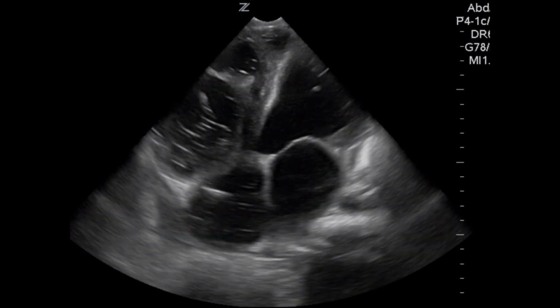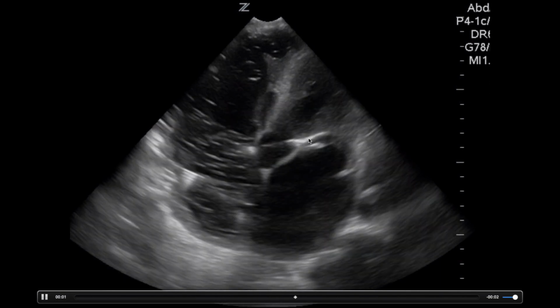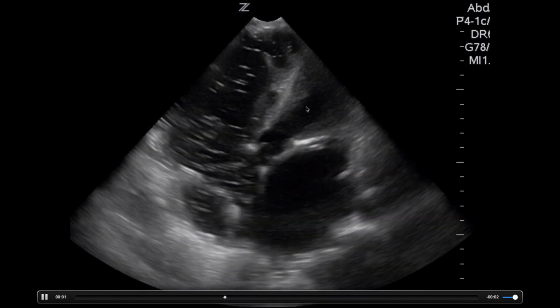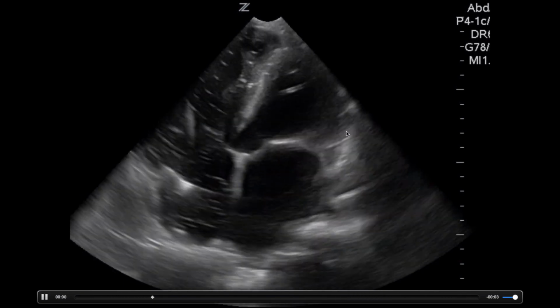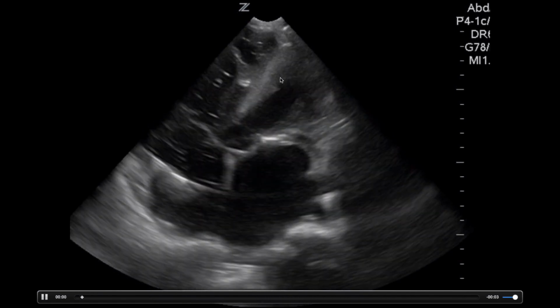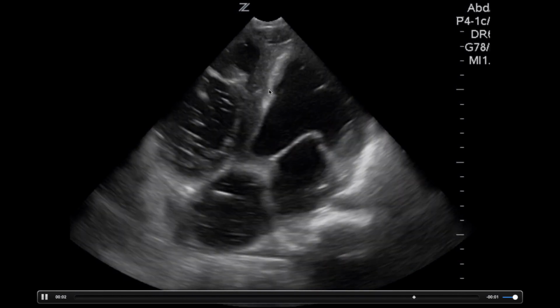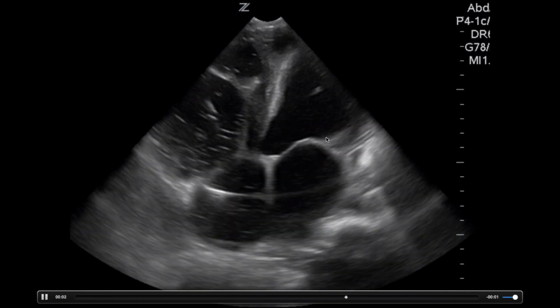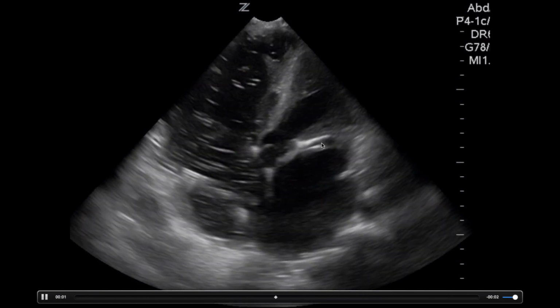Now here's a patient that was diagnosed with cardiac arrest, and clearly they have very low ejection fraction, very little blood moving between the heart here. It's an apical four chamber, so this is the right ventricle, left atrium, and mitral valve here. This is the aortic valve. But you can really see that there's sort of quivering of this left ventricle, and I was looking at this wondering if it was ventricular fibrillation or maybe just this pseudo-PEA where we have organized movement but just a really low pressure. And at the end of the clip, I see the valve moving, I think in an organized fashion, so I think this is a case of pseudo-PEA.